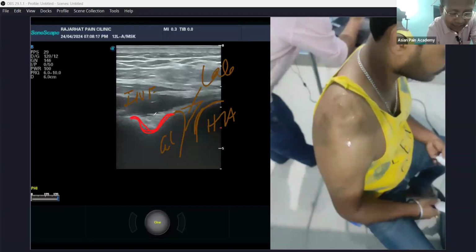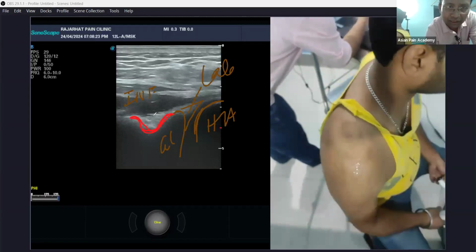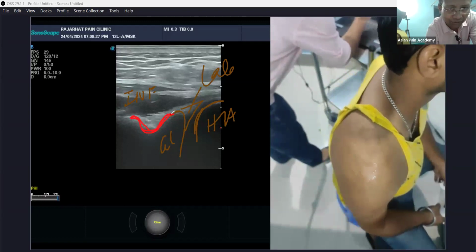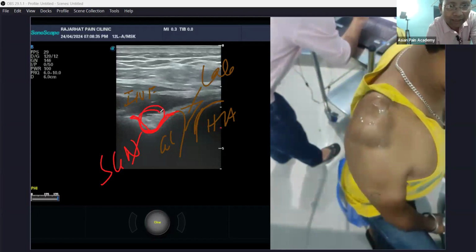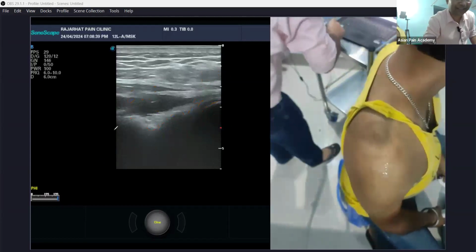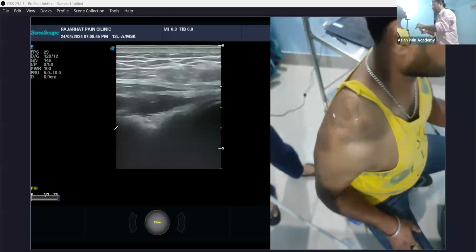Okay, just see the scapula bone. Today, while seeing the recording, you see the scapular bone, you will understand which is the area. Just medial to the glenoid, this is the spinoglenoid notch. So here we will search for a pulsatile artery, and if the patient is thin, we can see the nerve also, but in his case, we cannot see.